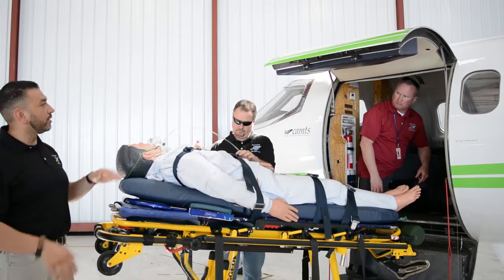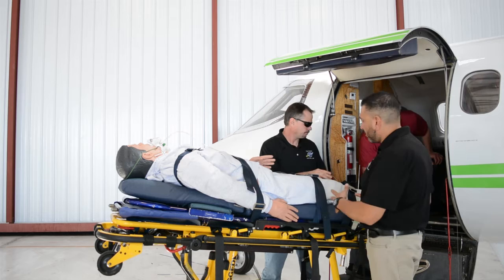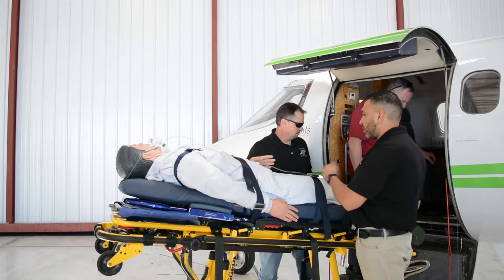The other thing we want to make sure is that all of our IV pumps, all of our equipment is accounted for, and that we don't have any kind of cables or our nasal cannula line hanging down. If we have IV pumps, we want to make sure that they're on the patient and secure and not able to fall off when we're transferring the gurney.